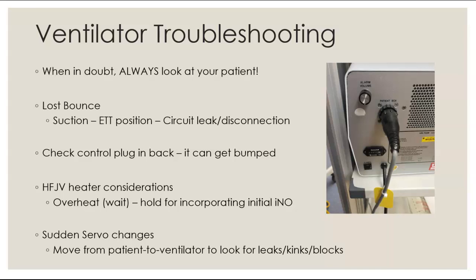One thing I've had, so this is the back of the jet. I've had people ram their computers and stuff into this patient box. That's essentially what is delivering the electrical power and control. And that causes my vent to malfunction. So make sure that's in a good, safe, protected location. That's just things I've learned in my experience. Make sure it stays nice and secure.